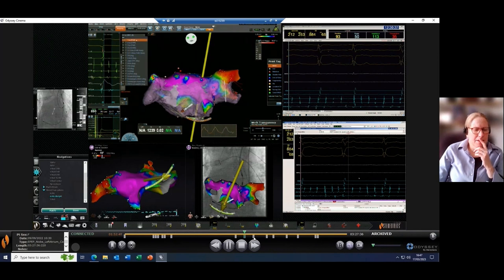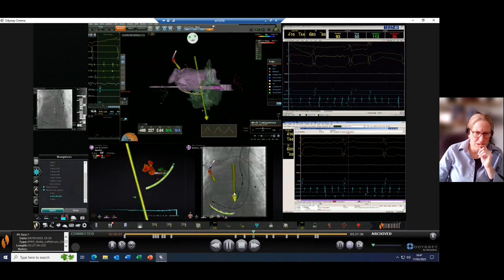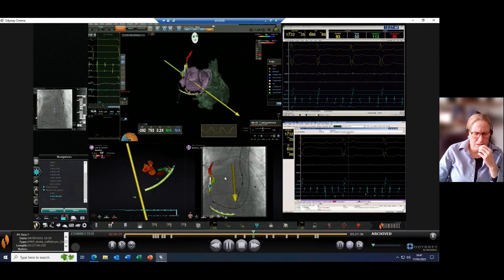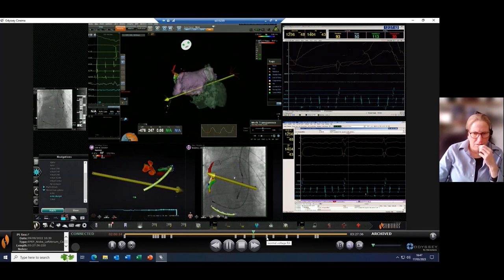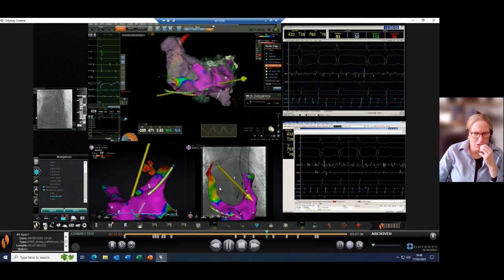So at some point, we felt that ablating on the ridge from endocardial is not doing the trick completely. So we went also into the left SVC, which is on the right side. It's slightly confusing. You can see again how easy the catheter can go in here. Again, a brachial approach for that. And we have also normal voltage in the right atrium, very easy to move and turn around.